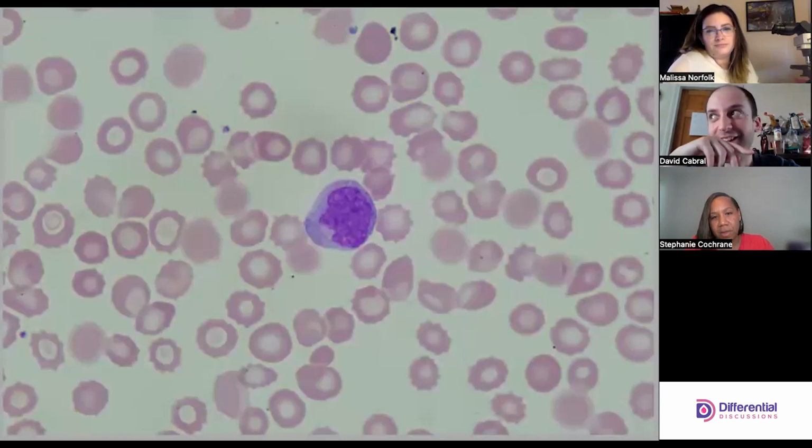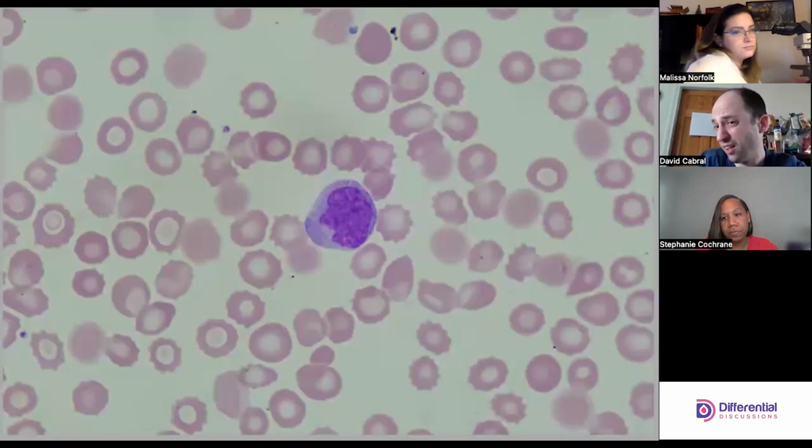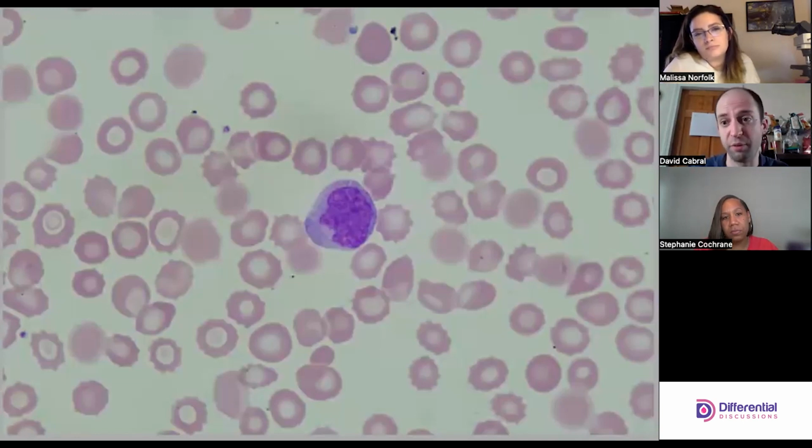I keep going back to the lymphs because that was what was the highest. So even if this is a monocyte, what is the issue with the lymphs being so high? The other thing that's complicating is the population of lymphs and monos. You could get a little bit of gating, so maybe that lymph is falsely elevated a little bit, or we just have a low N still. I mean, we haven't seen a ton of cells yet. I don't know.